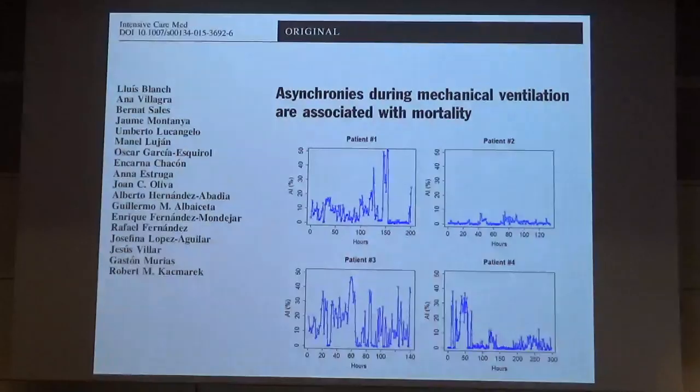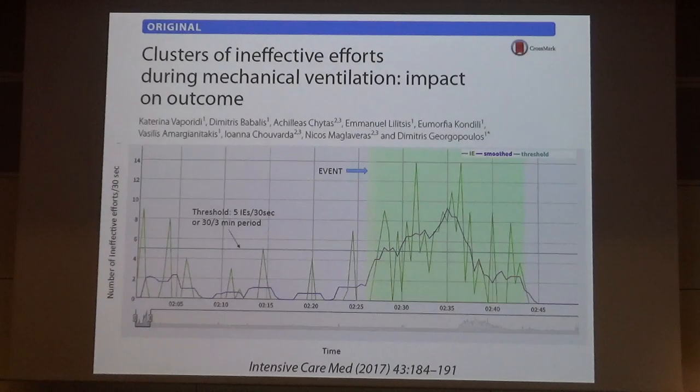And I think this is an important point because patient-ventilator interaction may vary over time in the same patient, and even very brief clusters of asynchronies were found to be associated with poor outcome.